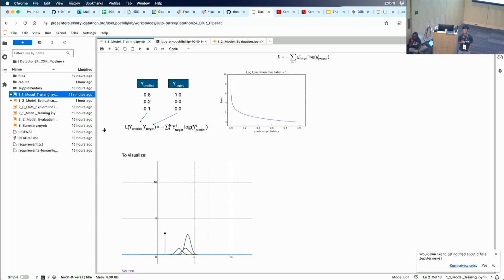That's right. That's what we are going to talk about later. If we don't have any strategy to early stop our training, then we have to care about how many epochs we are using. But if we have the early stop strategy, maybe we don't care about how many epochs. Okay, I'll show you later. He has 2 questions.